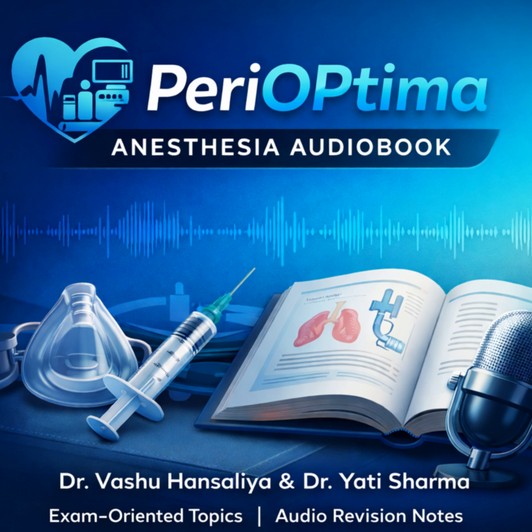This sounds fascinating. Unpack this for the listener. This feels like one of those aha moments for understanding ECMO. It is. Imagine a patient on peripheral VA ECMO. You're draining blue deoxygenated blood from the femoral vein and pumping red oxygenated blood back into the femoral artery. That oxygenated blood shoots up the aorta. It's retrograde flow. Right, so the legs, the kidneys, the abdomen are all getting this lovely oxygenated blood from the ECMO circuit.